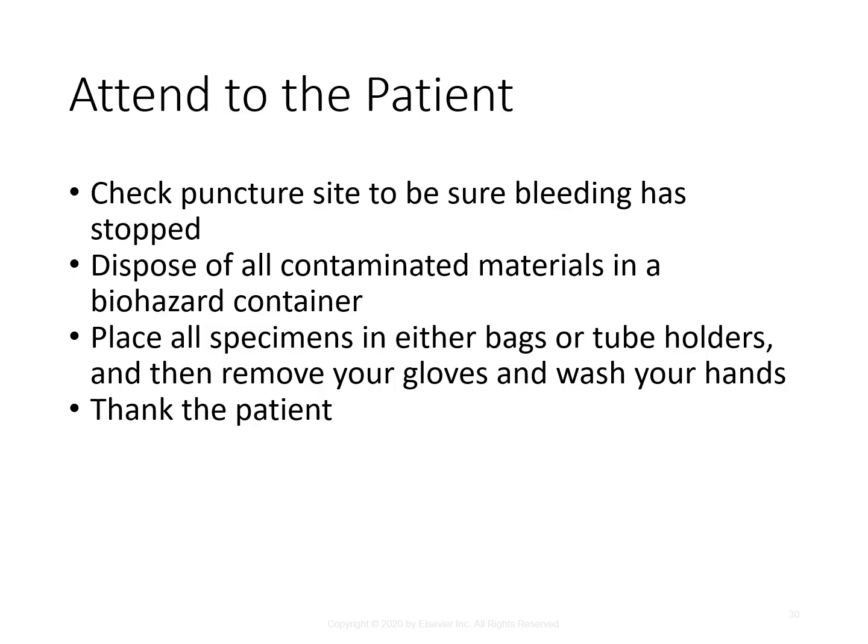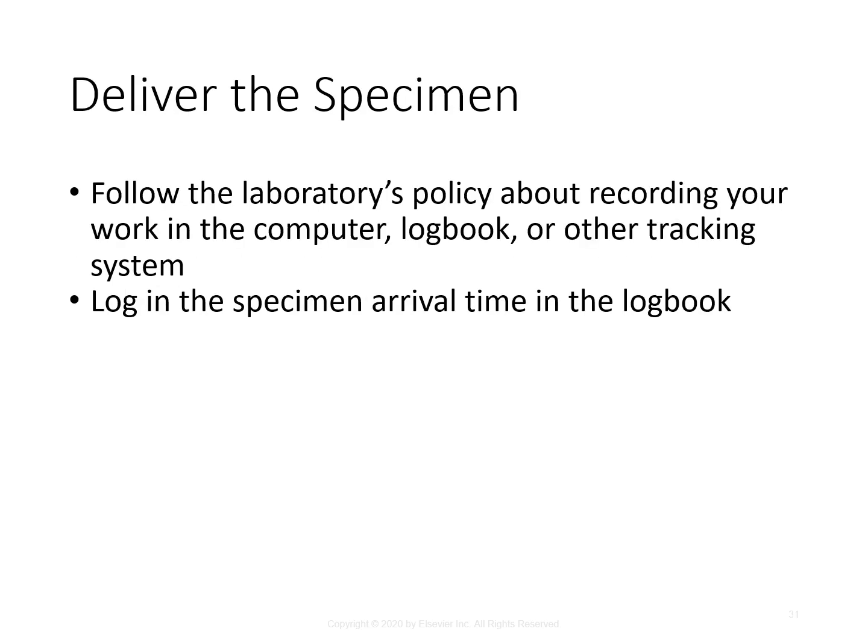In some inpatient situations, it is appropriate to report to the nursing station that you are finished with the patient as well, so you'll learn depending on your facility if that's needed or not. And then you're going to deliver the specimen. You're going to follow your laboratory's policy about recording your work in the computer logbook or other tracking system, and then log the specimen arrival time in the logbook or computer.